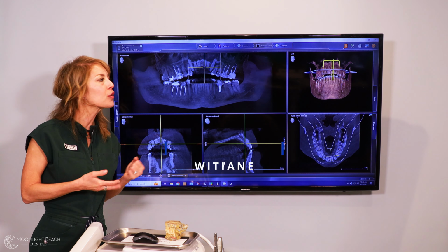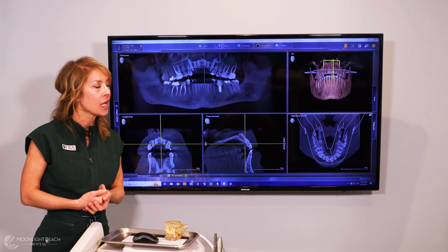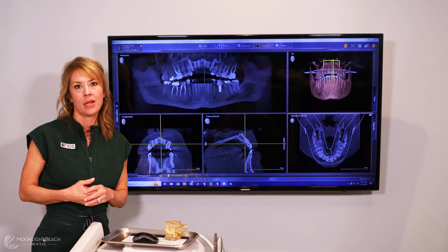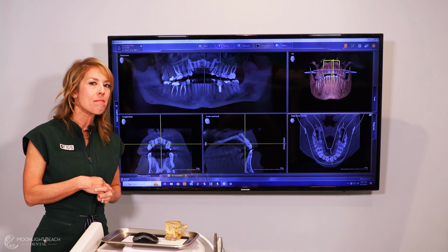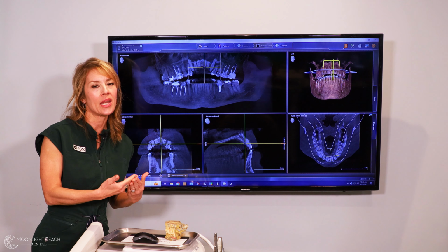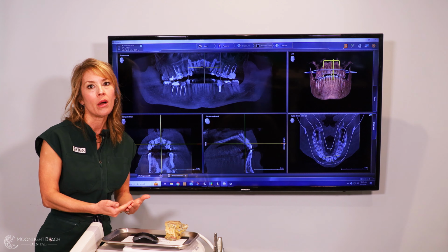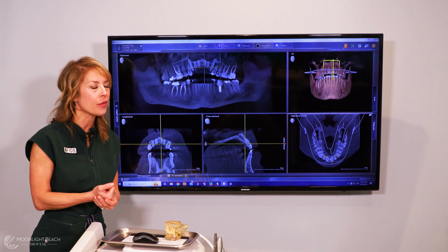I wanted to take the time to make this video again on what we use 3D cone beams for and how our new patient exams are different. This patient came in with the chief concern about failing root canals, many of which had been done and redone, and then he was still having pain on these teeth. He was also concerned that they were impacting his health.